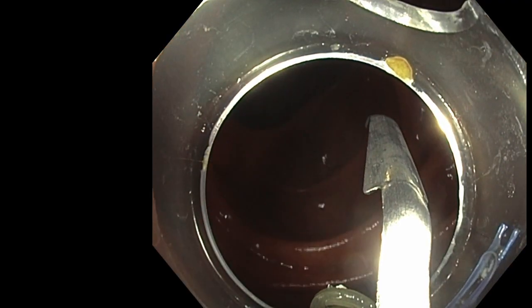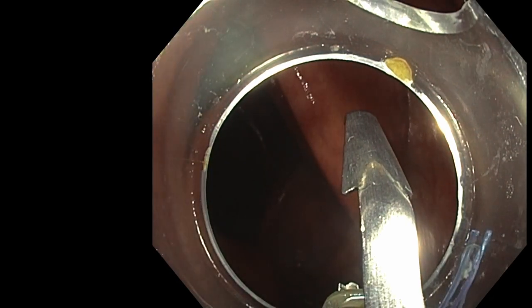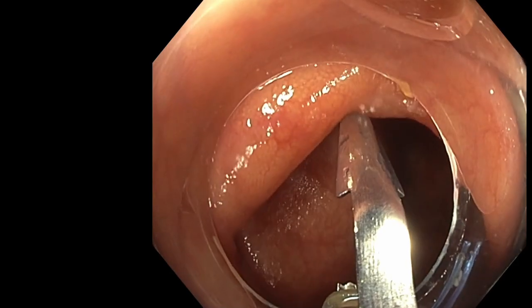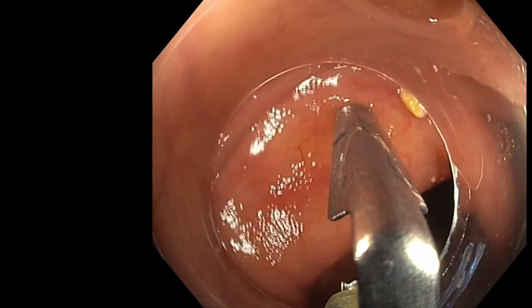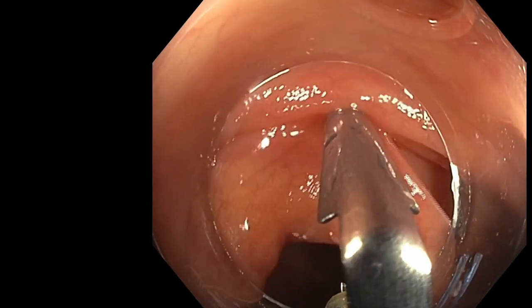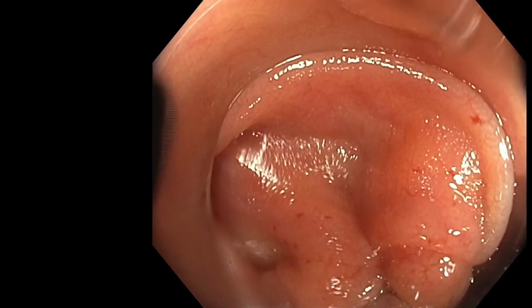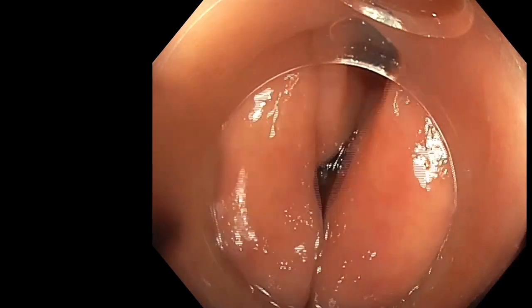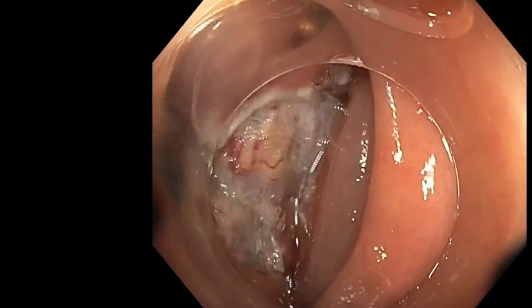And after, I want a very strong traction, if possible far from the bad gravity side. So I deflate the colon a lot and try to fix it on a fold at 90 degrees on the opposite side. I deflate again in order to catch a lot of tissue and avoid the clip sliding or removing.